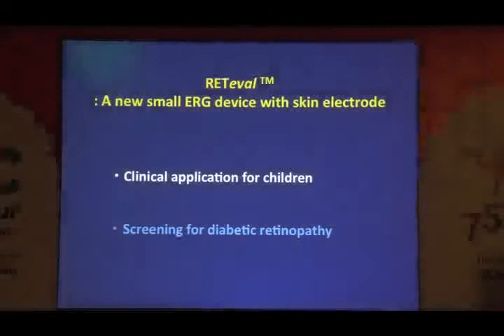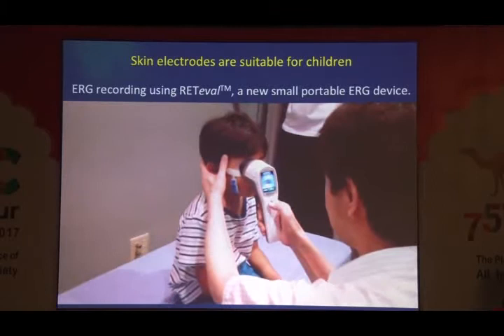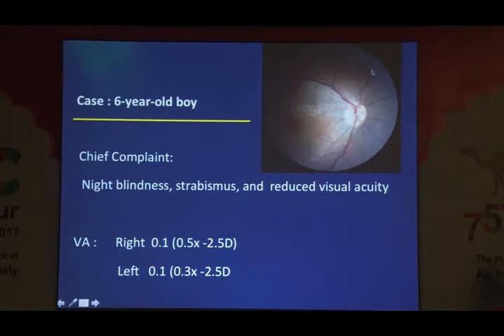This small ERG device is very useful especially in children. Because if you can put a single tape here, you can start ERG recording even from four-, five-, or six-year-old very small children. And you can see on this monitor if the child is actually opening the eye. I recorded ERG from this boy because the parents complained that he may have night blindness, strabismus, and reduced visual acuity of 0.5 and 0.3, and the retinal reflex was abnormal.